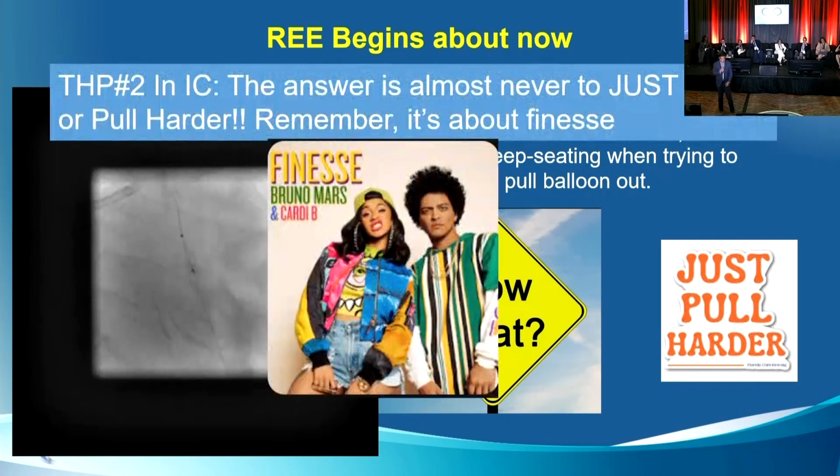Okay, so my take-home point number 2 is, in general, the answer is almost never to just push or pull harder. Interventional cardiology is a finesse sport. It is not a muscle sport.